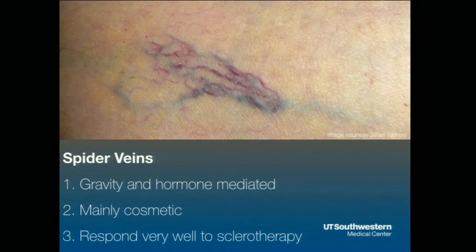Spider veins, this is most common in women and patients that are on their feet a lot. It's mainly cosmetic, and these respond well to sclerotherapy. Sclerotherapy is where you take a very small gauge needle and cannulate the vein and inject it with STS foam, which is basically dishwasher detergent, foamy soap that irritates the lining of the vein and causes it to scar down.